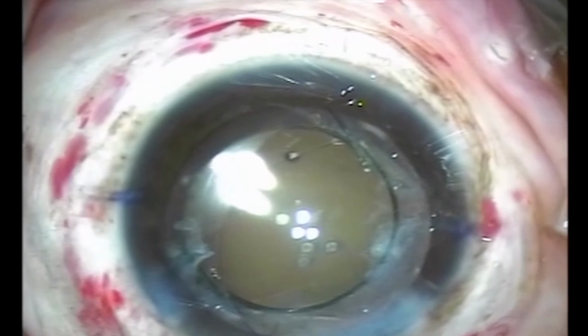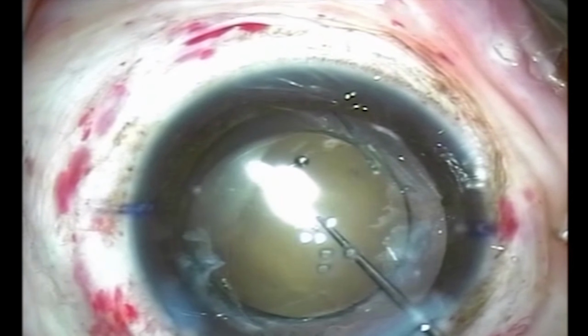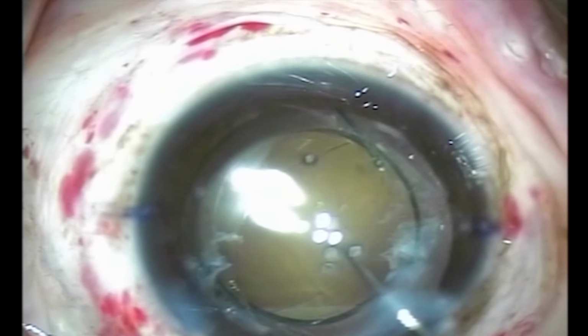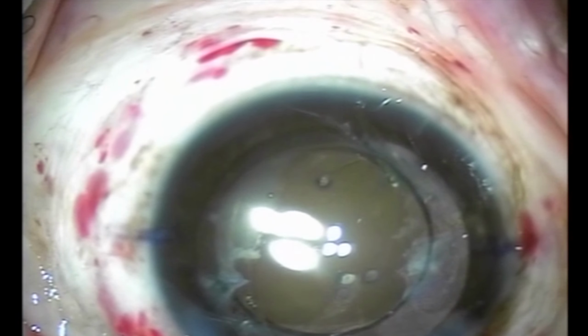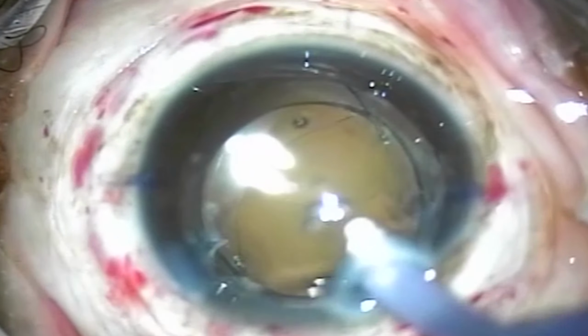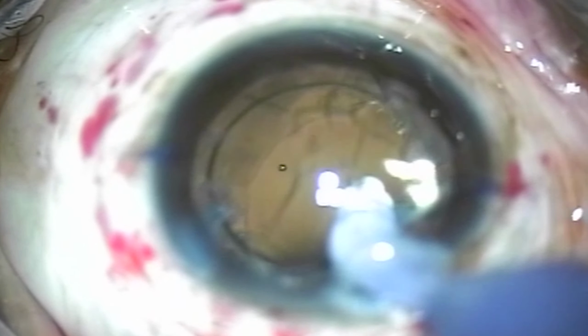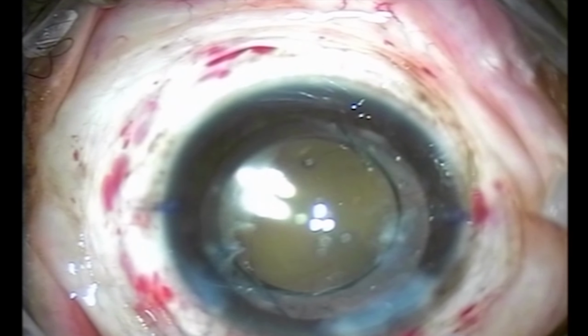We can see the ovalization of the capsular bag edges, and here I am testing the platform and feeling nice and confident about good centration and central clarity for this patient's vision. Using irrigation aspiration, I remove the viscoelastic and also try for any more residual cortex, not bothering about the peripheral fibrosis, which could be helpful to us.